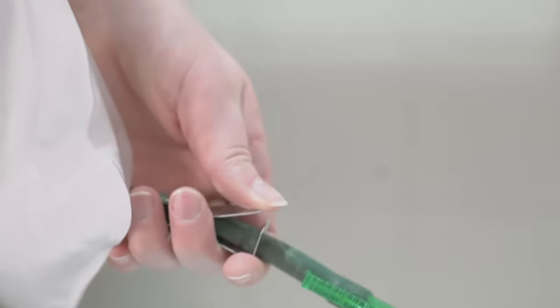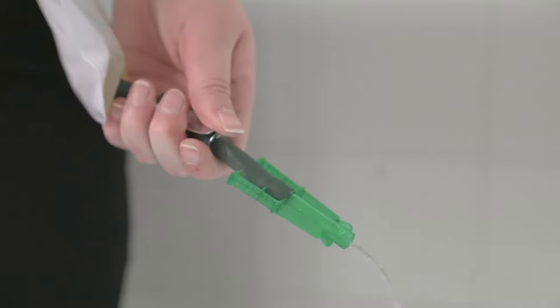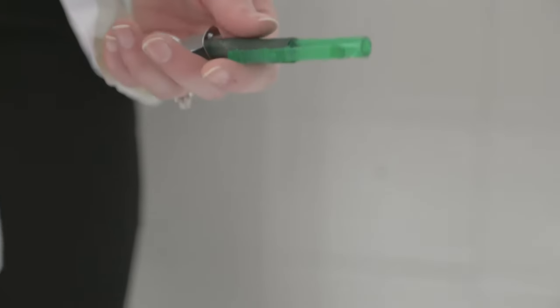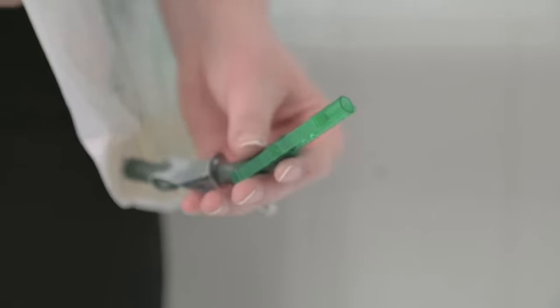Gently lift up the edge of the metal clip until it releases from the rest of the clip. Empty the bag into the toilet. Once empty, reclamp the metal clip. Take some toilet paper and wipe the end off, and then reclip the green clip.